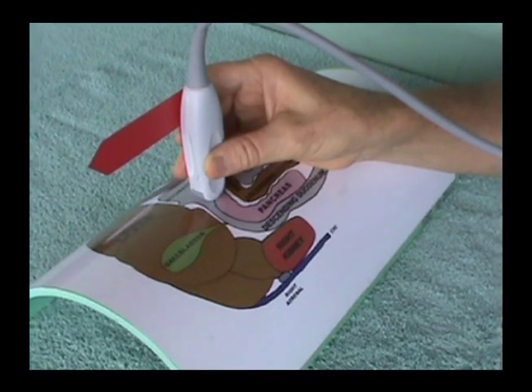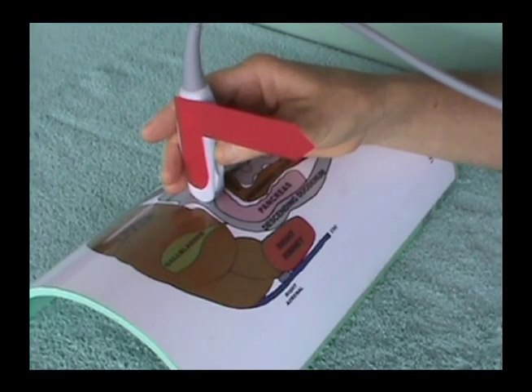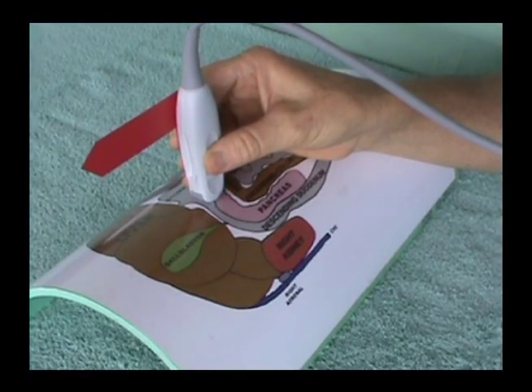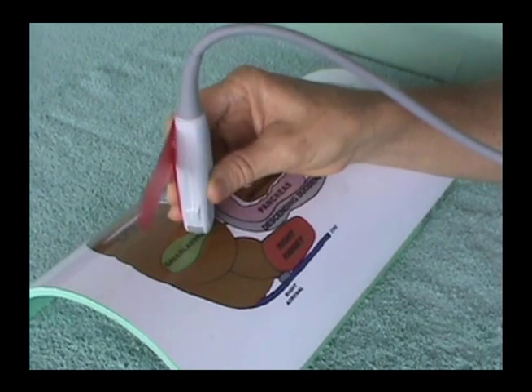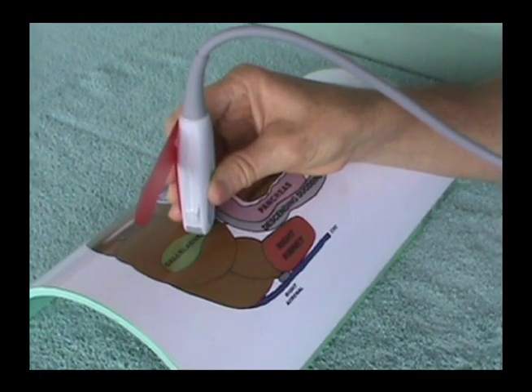Many organs of the body are lined up in the sagittal and transverse planes of the patient's body. Some organs, like the spleen and intestines, are not. With some organs, like the gallbladder, you may need to rotate off sagittal, or just enough to line the ultrasound beam up with the long or short axis of the organ.